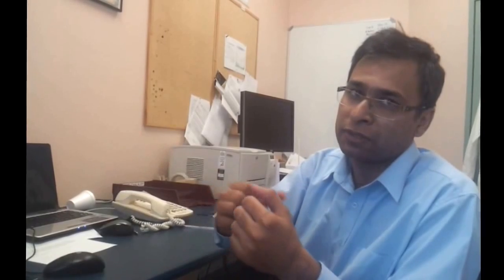If you set the trigger too high, 4 or 5, now what's happening is that the patient is trying to take a breath and the machine is not giving the breath because you've set the trigger too high. So please don't do that. Make it easier for the patient to take a spontaneous breath, so keep it low. How low? Probably 1. I don't think you could set 1 on C3000s, probably 2.